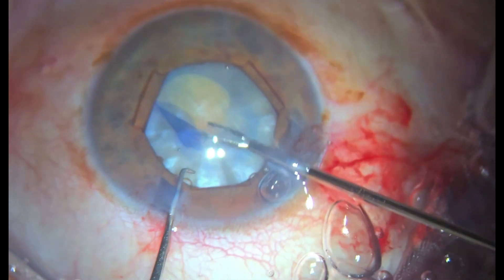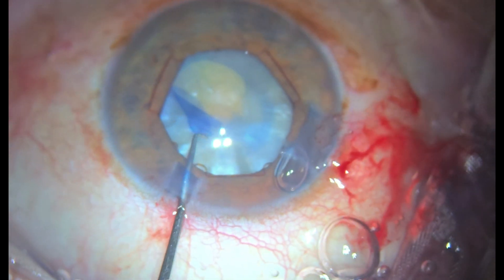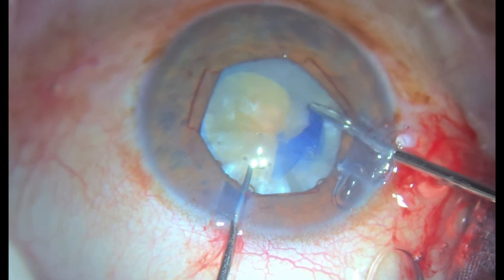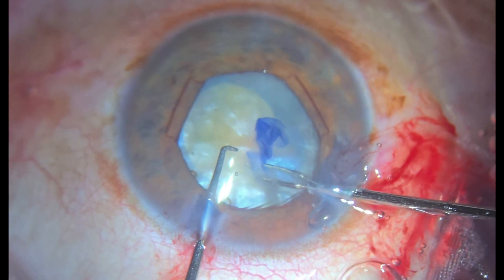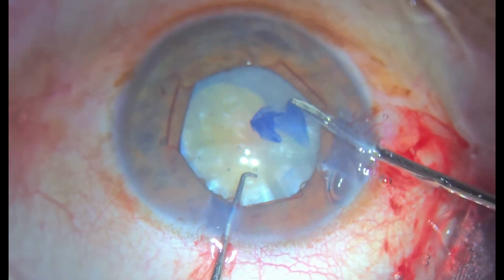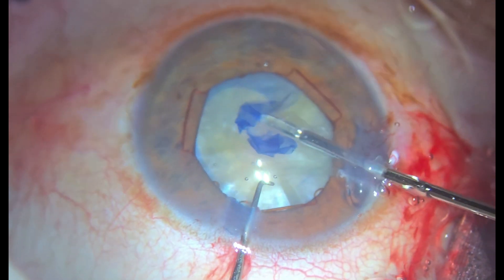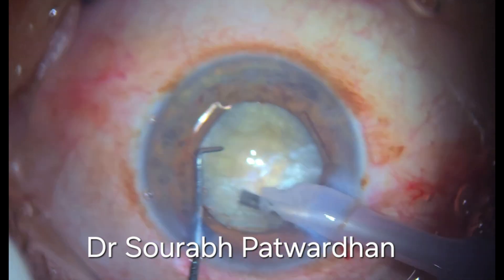Now here you can see that the forceps is not holding the capsulorhexis tear and I have changed the forceps. So if you feel that the instrument you are using is not proper, you should immediately change it. And here it is important that I go closer to the flap again and re-hold rather than pulling this flap from away, because that is one of the reasons for capsulorhexis extension in these cases.